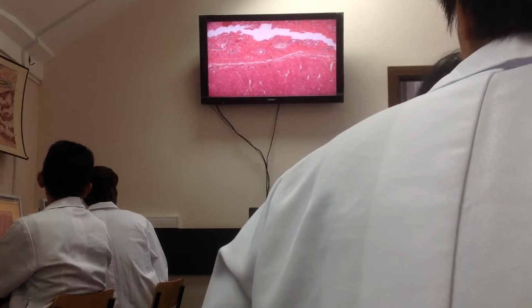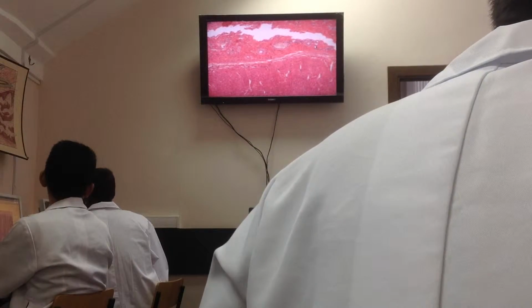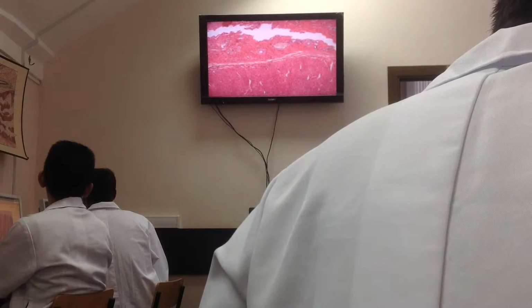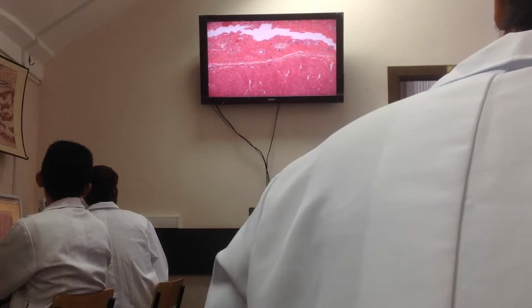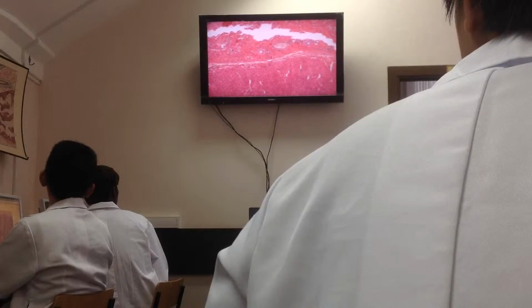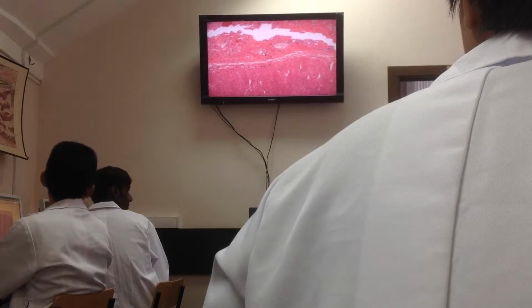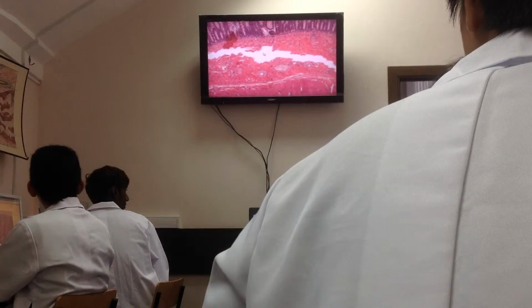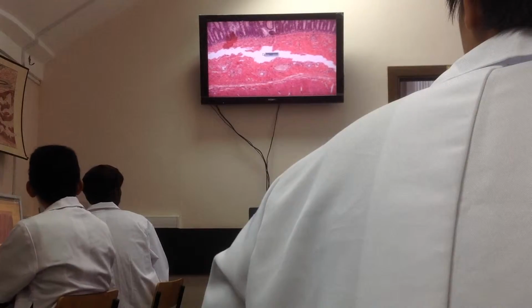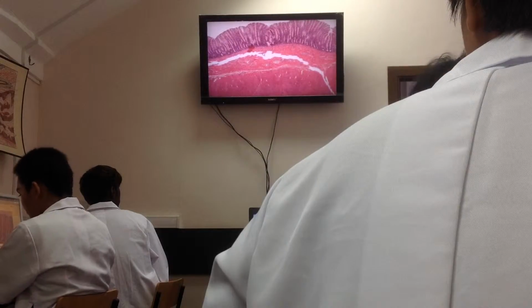Some of you passed control already, some not yet, but you can differentiate the blood vessels. This one and this one. Vein. And here artery, you see media. Now you know histology already. So in the connective tissue of the submucosa we have blood vessels, nervous plexuses may be present here.